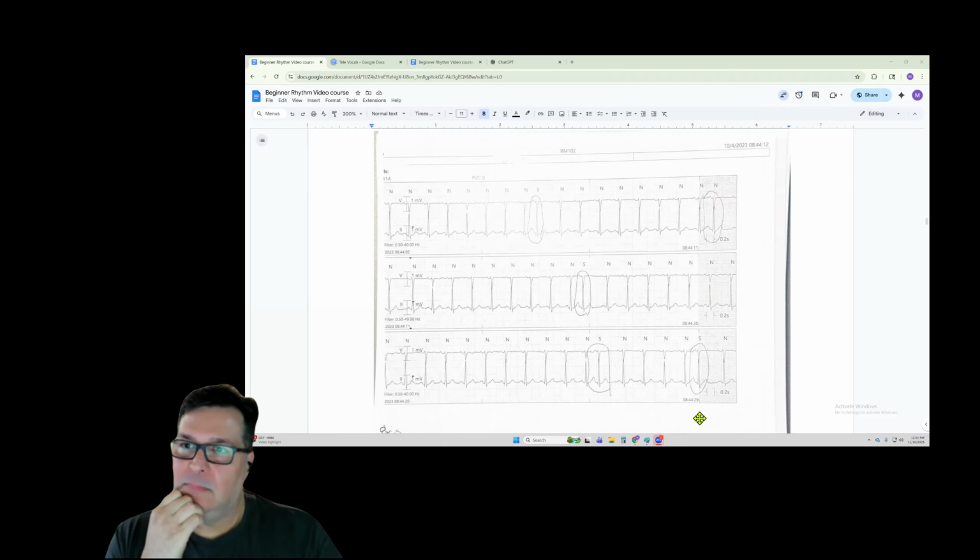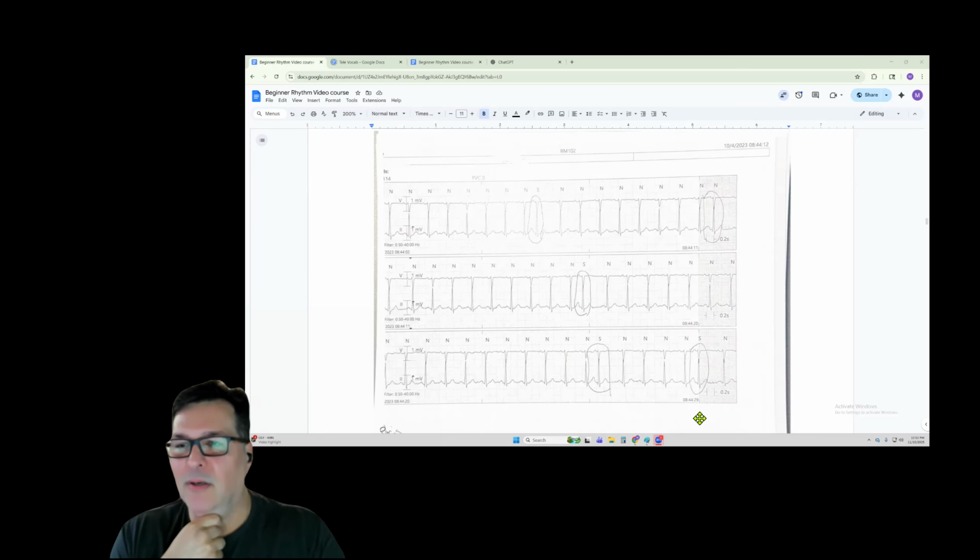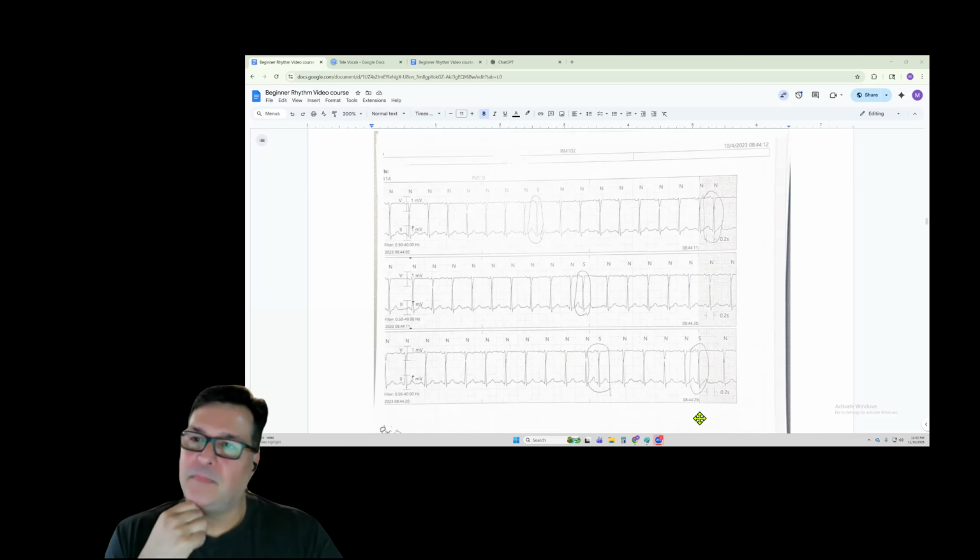So on top of that, adding in the multifocal atrial rhythm, nobody's going to know what you're talking about. That's good to know though. So even if it is multifocal, it's okay to communicate with the nurse that it's just a wandering atrial pacemaker. We bundle them together for sure. And of course, having some knowledge about what that is helps you talk to the nurse about it if there's any confusion. But those can kind of just be together.